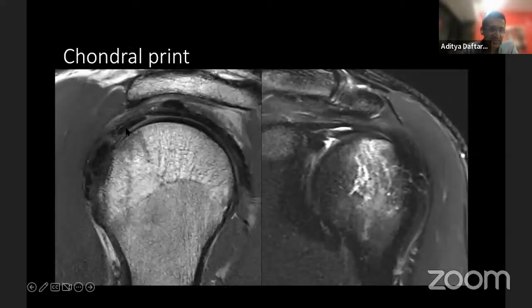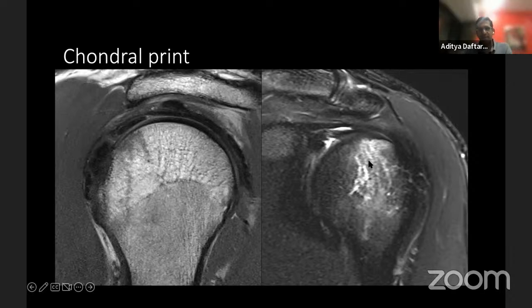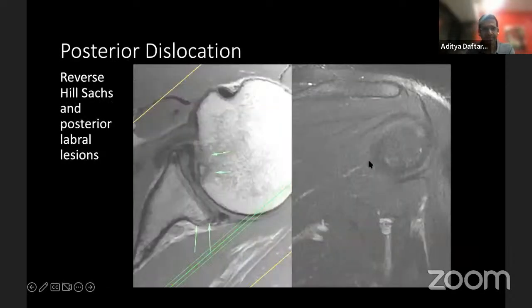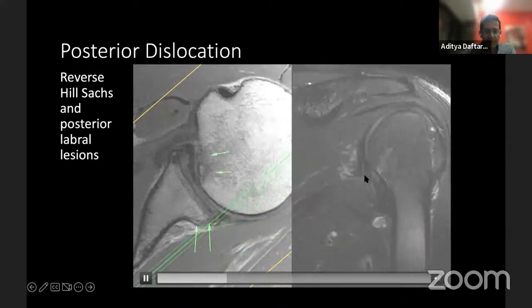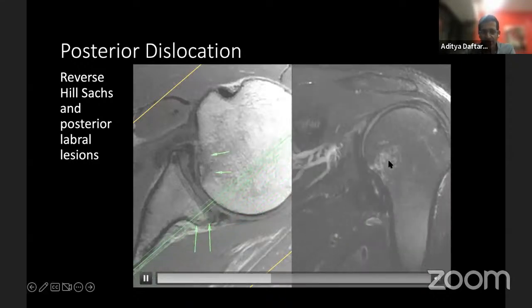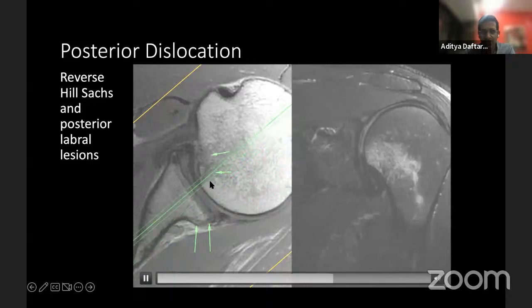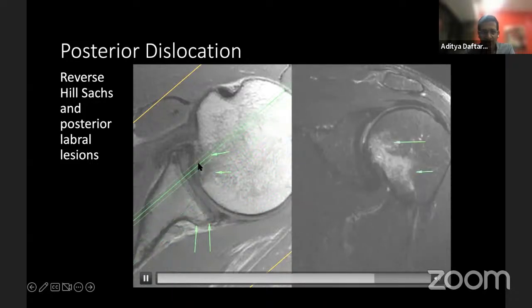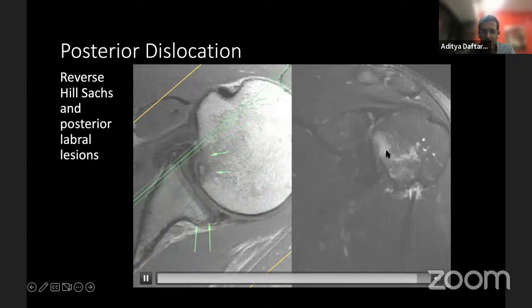Here's a case demonstrating internal impingement with a flattened biceps tendon producing bony remodeling in the anterior superior humeral head — the chondral print appearance. Here's another example of a posterior dislocation with bone marrow edema, a reverse Hill-Sachs lesion with extensive bone marrow edema, and a sizable posterior labral tear where the labrum has peeled off the posterior glenoid.